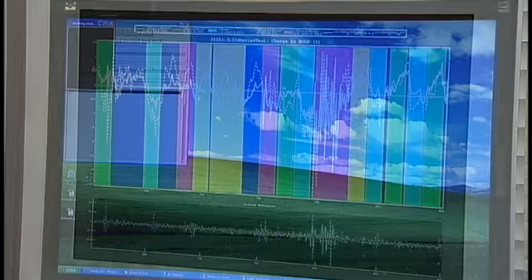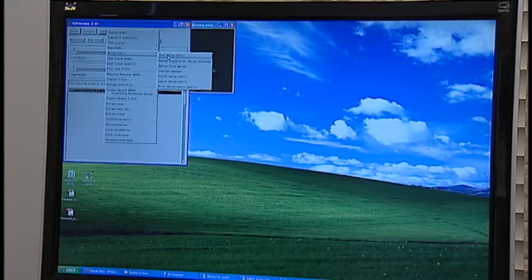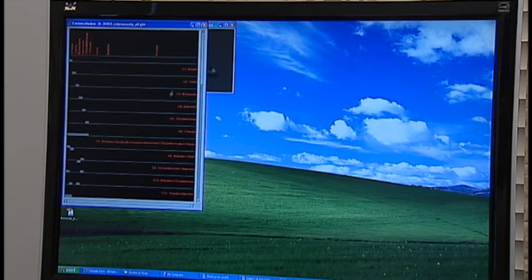From time to time, we exclude individual runs or even whole participants when the noise due to movement is excessive. Once we confirm good data quality, we use FIDL, a Washington University St. Louis program, to create general linear models of the data for each participant.